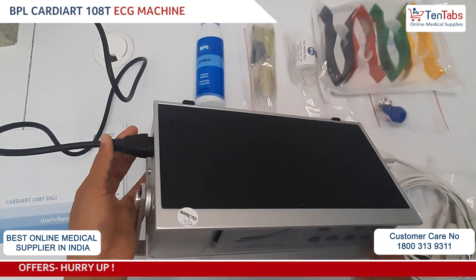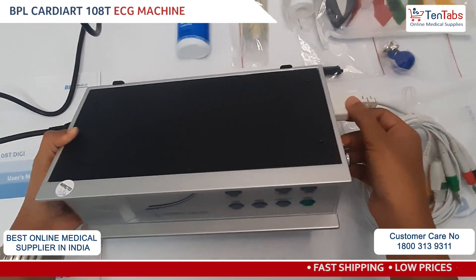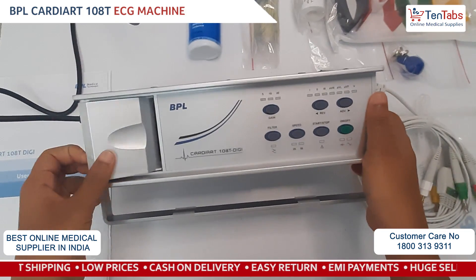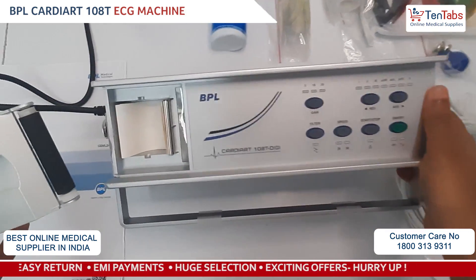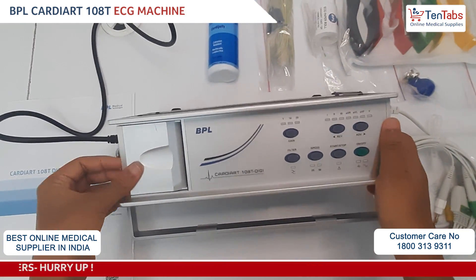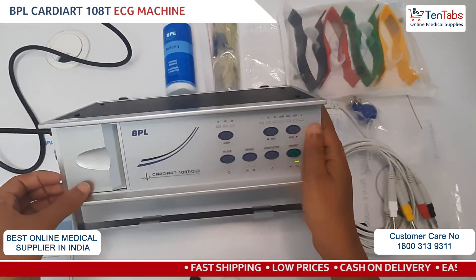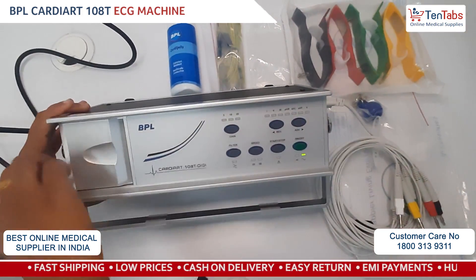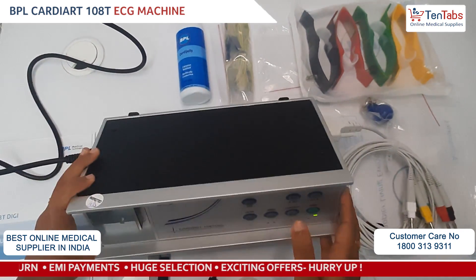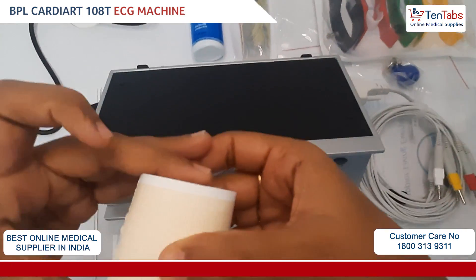So let us connect the power cord and the patient cable. Here we have connected the power cord and the patient cable towards the right. Also, this is the compartment where you put in the ECG paper roll. I will show you how to put the paper roll in — so first we will remove the outer cover and put the ECG paper holder inside.